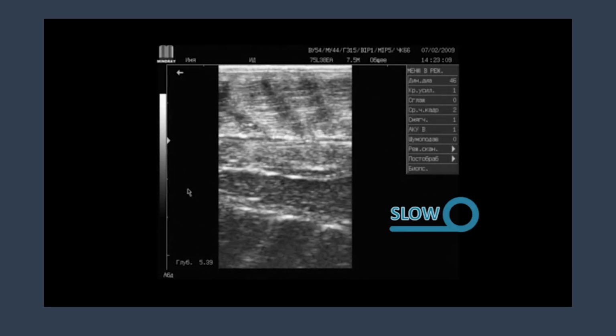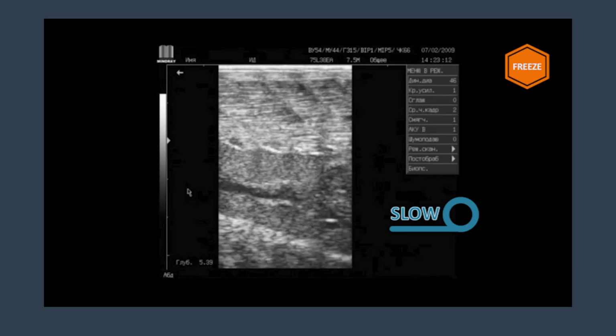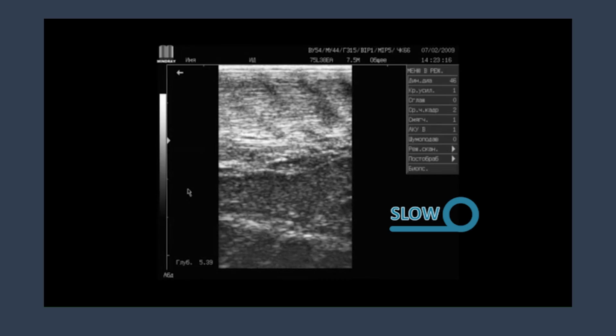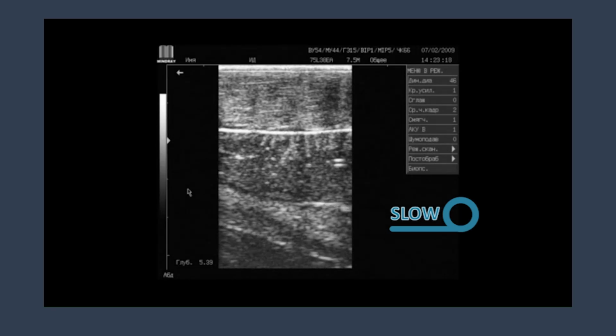In this case, the diagnosis in the beginning is quite correct. And the female gonad at the beginning of the maturity stage three is clearly visible. But then the operator begins to change the inclination of the transducer, and at some point the kidneys appear on the screen, which are visually similar to the male gonad. Therefore, it is important, even if you are confident, to pass the sensor along the entire gonad, and not to stop only on one fragment.